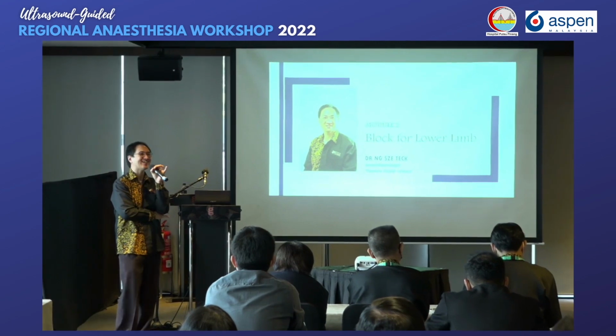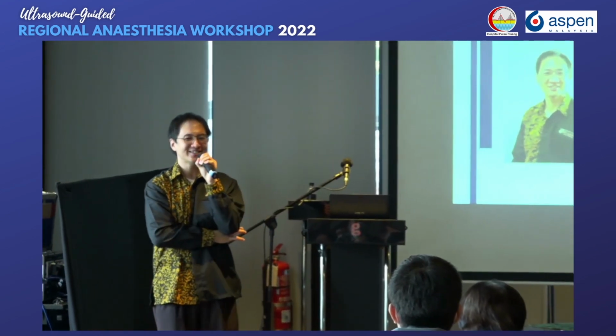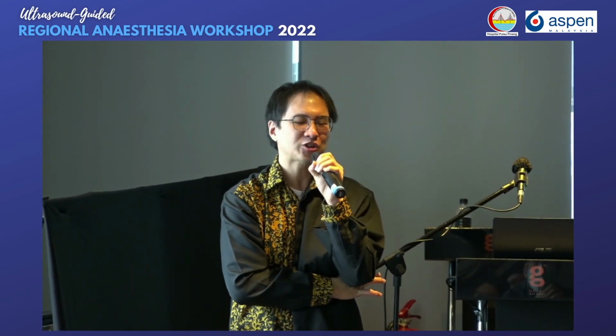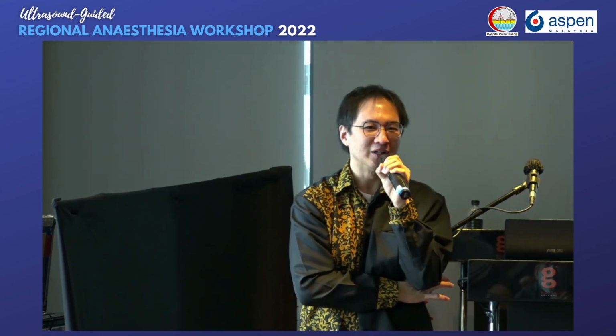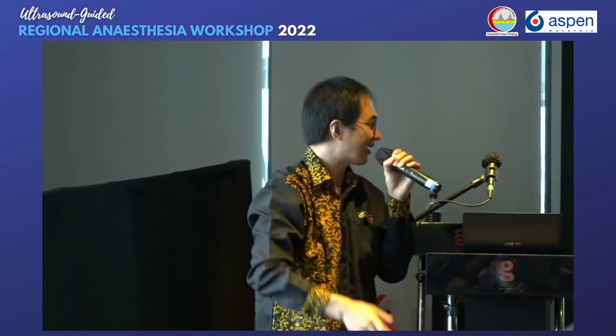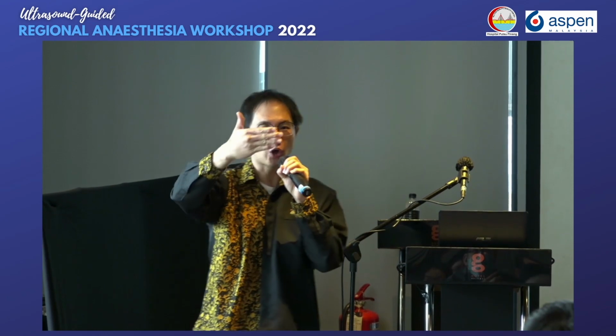For BKAs, yes, we have done popliteal sciatic nerve block before, but actually it's not a true popliteal sciatic nerve block. We slide the probe as high as possible, like what I showed you just now. At the popliteal crease, there are two nerves, then they join together.